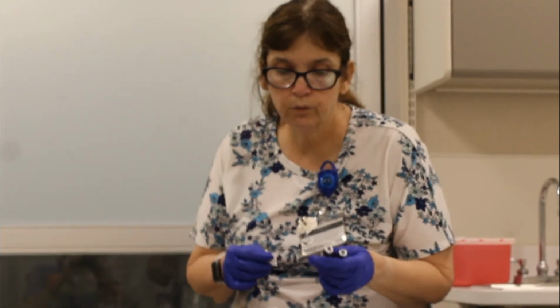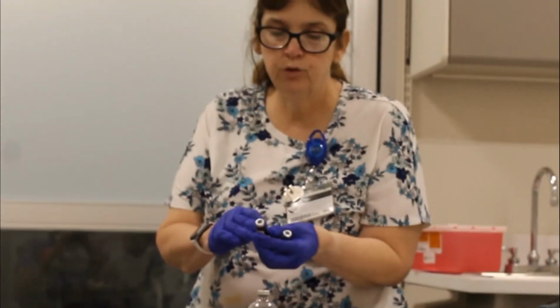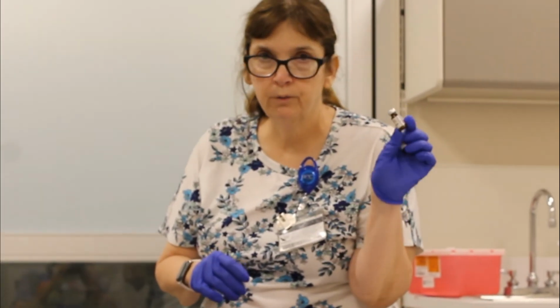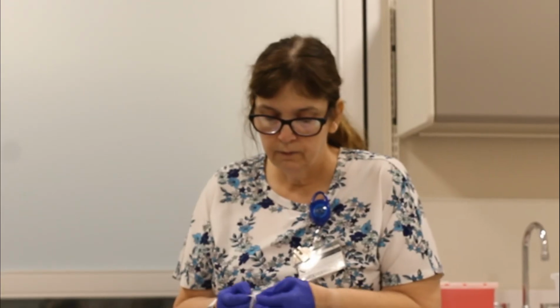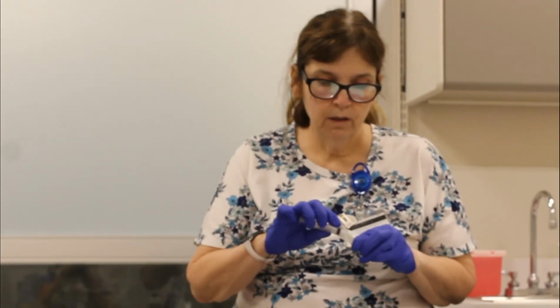All right, so the doctor ordered 40 milligrams of furosemide. And in this case, I have 2 vials, each vial has 20 milligrams in it, 10 milligrams per mL. So I'm going to draw up 4 mLs based on my calculation. Now in this case, I'm going to use another of the blunt tip needles because it makes drawing up a lot easier.